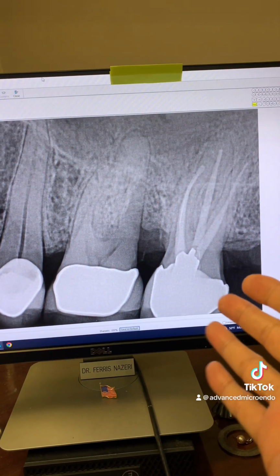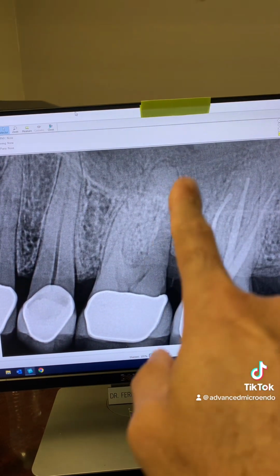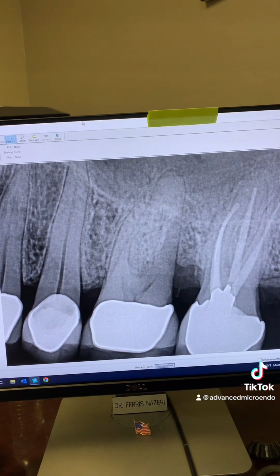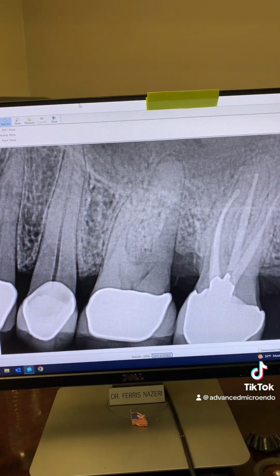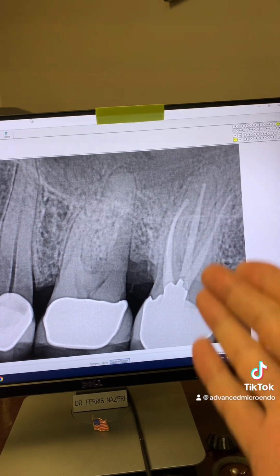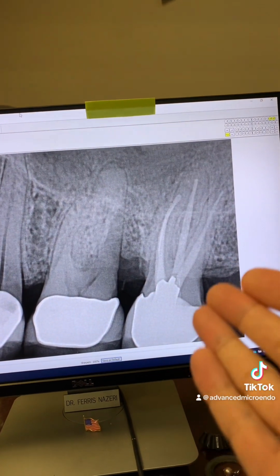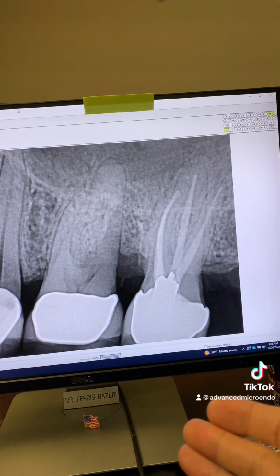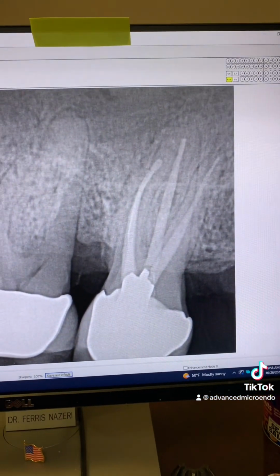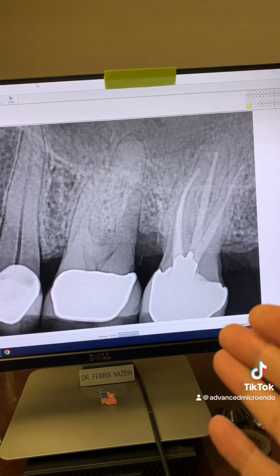And this was just now. Patient came in to see me for root canal therapy of tooth number 14. The periodontist amputated the distal buccal root, so we're going to be working on tooth number 14 next. But take a look at tooth number 15 that we'd done a root canal on over 10 years ago. Those periapical lucencies healed completely. Patient still has the tooth. Infections completely healed. His body has regrown, regenerated bone. As you can see, tooth is in full function, zero symptoms.